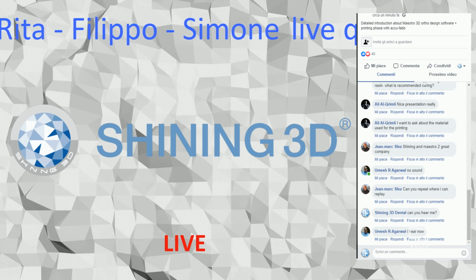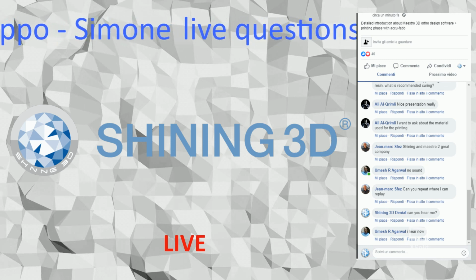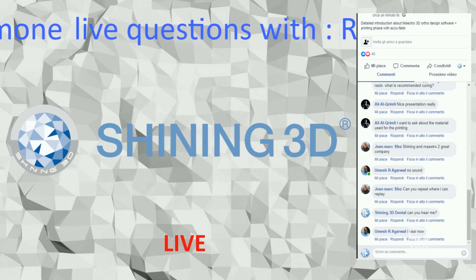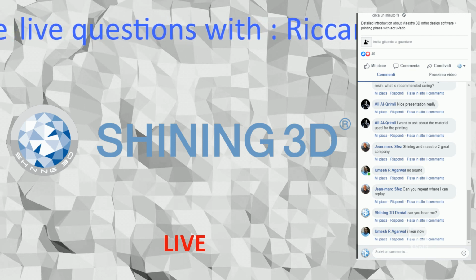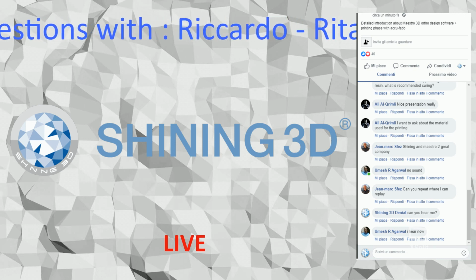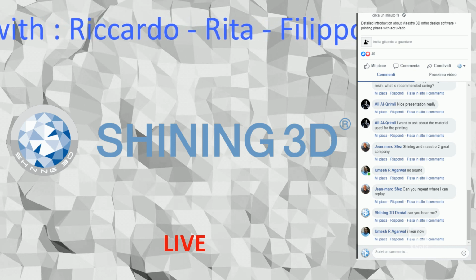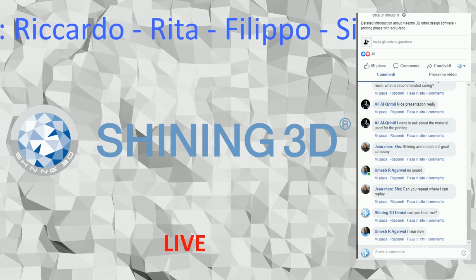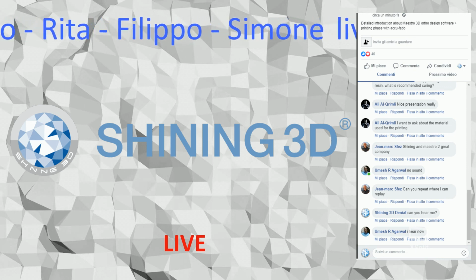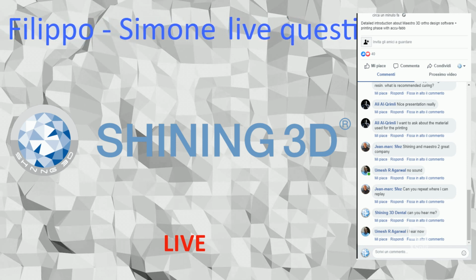The last question was regarding the materials. I hope that you heard the answer. In case you didn't, I'm just repeating it again, sorry. What I meant is that the purpose of the video was to give an overview of the workflow from the design on Maestro 3D to the 3D printing. The material we used is a material that we are testing now. It's not something that we can already provide, but we will be more precise in providing information regarding materials in the following weeks.